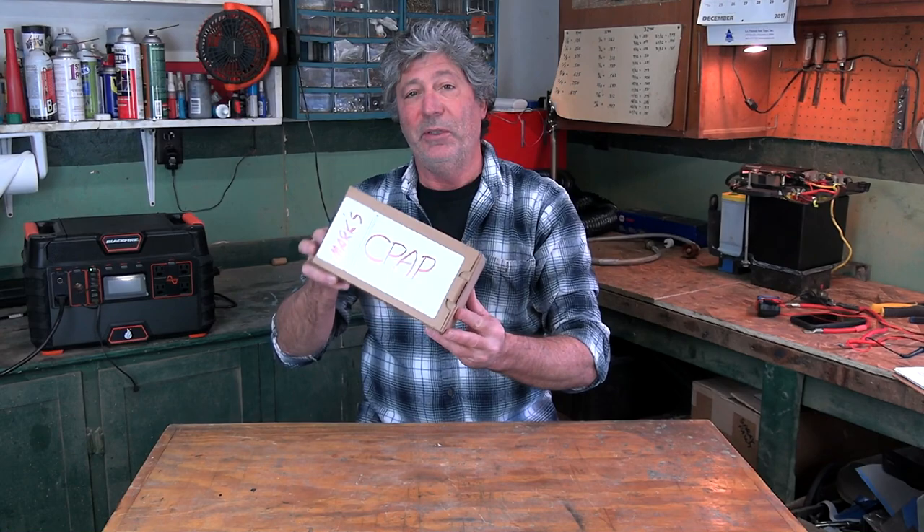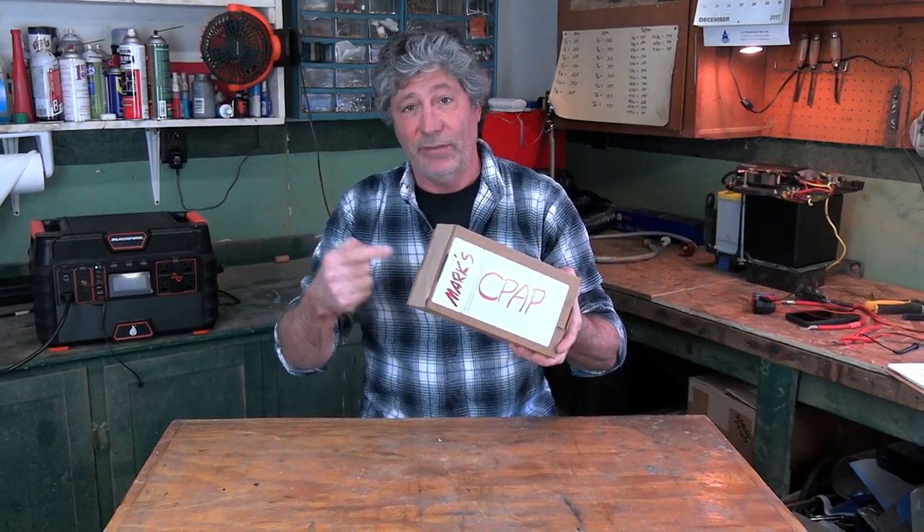I'm going to show and tell you all about the best, most compact CPAP system for off-grid camping. Like you, I have sleep apnea and have to use a CPAP machine at night to stay alive. When I go camping, my new complete self-contained, no-electricity-needed CPAP system fits in this little box. This is all of it.